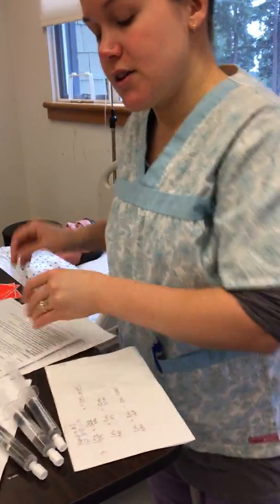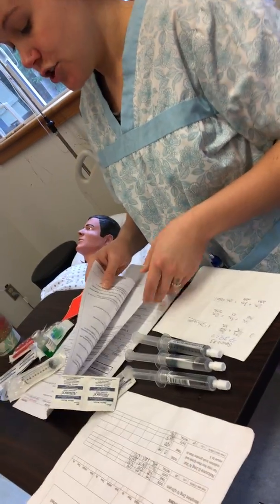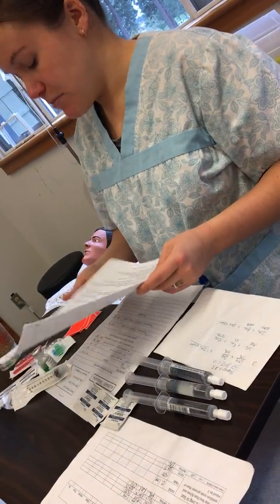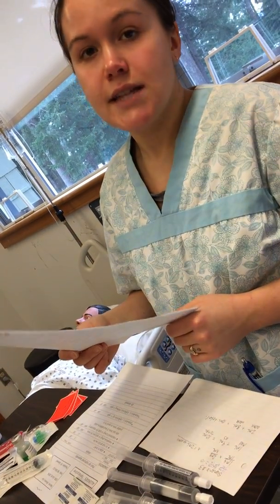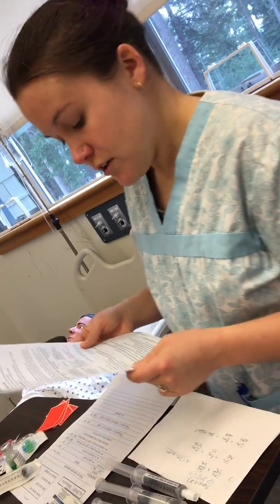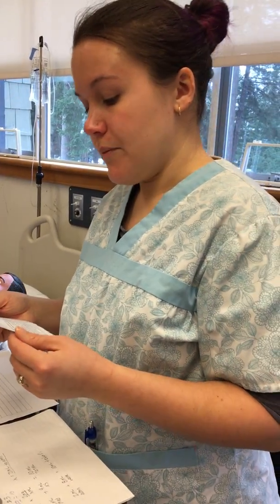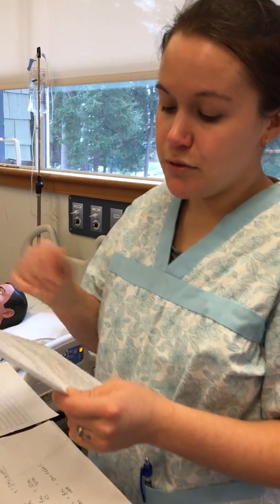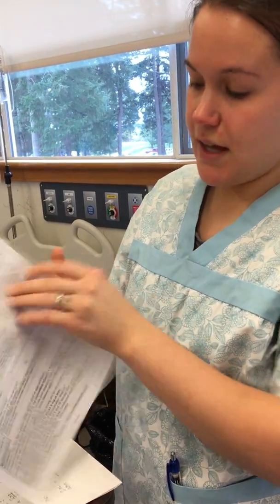So good. I check on the MAR to make sure she hasn't had it in the last hour, and she hasn't. And then I check the IV monograph, and my morphine comes in an ampule. It's 10 milligrams per milliliter. So on here it says I need to dilute it to 1 milligram per milliliter. And it says to give it over 2 milligrams over 2 minutes, or 2 milligrams over 1 minute, so I'm going to give the whole dose over 1 minute. It says I need to do baseline vitals, and I just check to make sure that it's compatible with normal saline that I'm mixing it with, and it is.